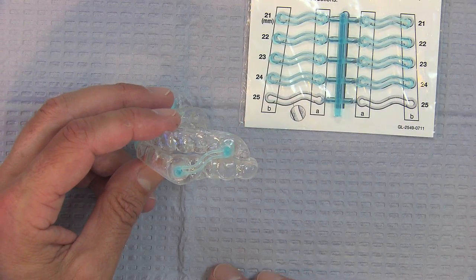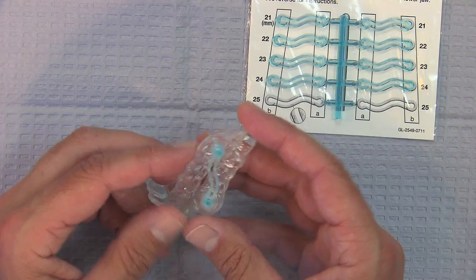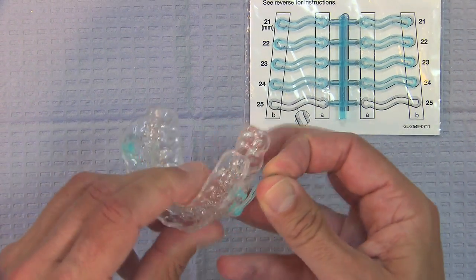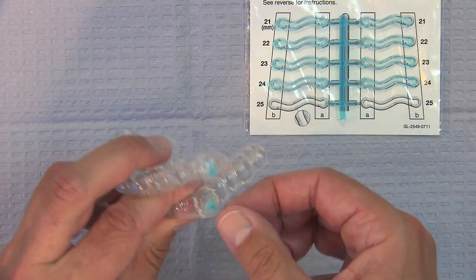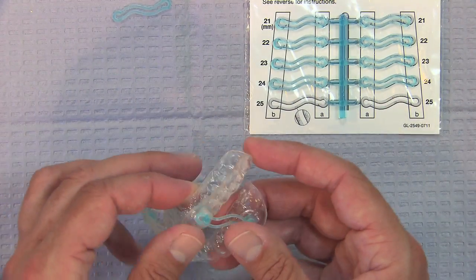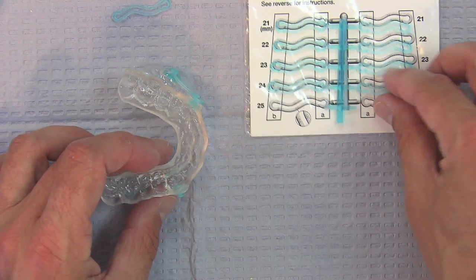So let's say we've got the 25 millimeter straps on and the patient is still experiencing snoring. What we would have them do is simply remove the strap. The lower one slides right off. The upper one needs to be pushed a little bit and shoved off just a little bit, as you can see. And leaving the other one on just to help keep these two together, the patient takes off one of the 24 millimeter straps.